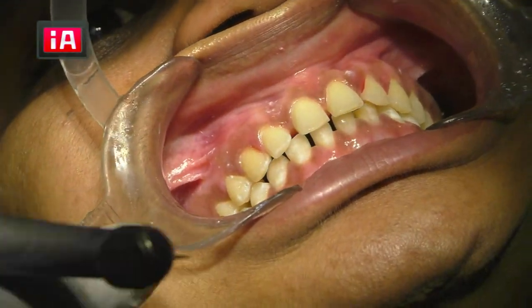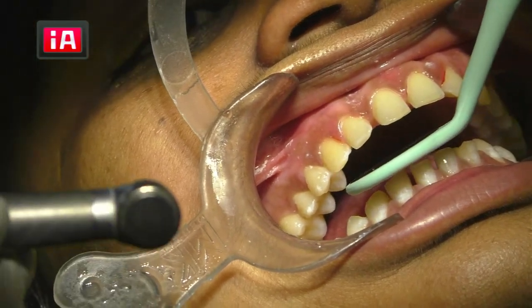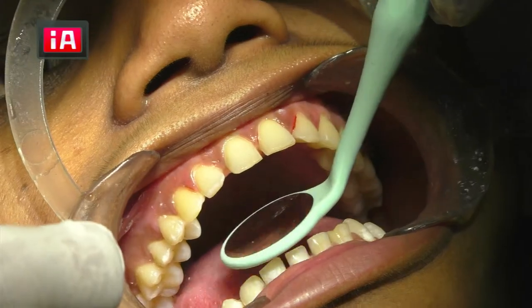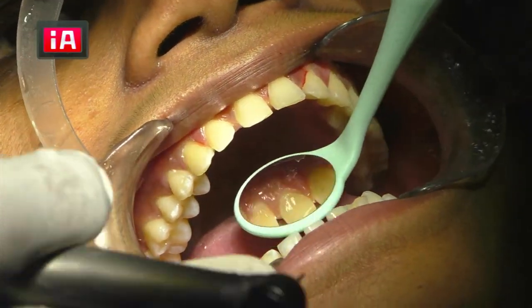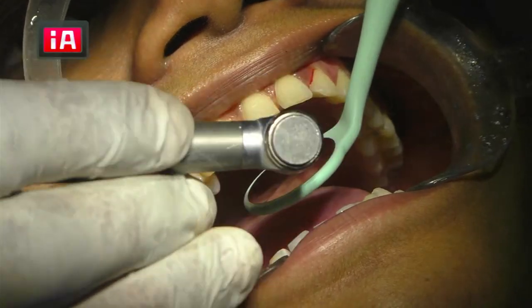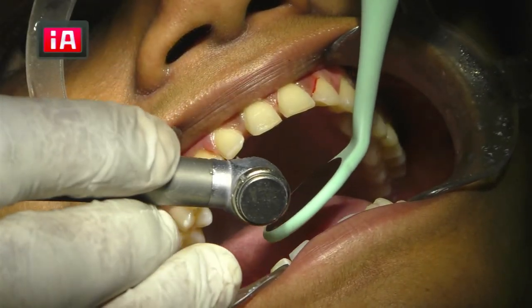Incisor lingual. Okay, this is the tricky part, because you have to work with indirect vision. Slightly close. I think it's clear. See? So what happens here? It becomes very difficult because water comes on the mirror. Okay, it becomes very, very difficult.